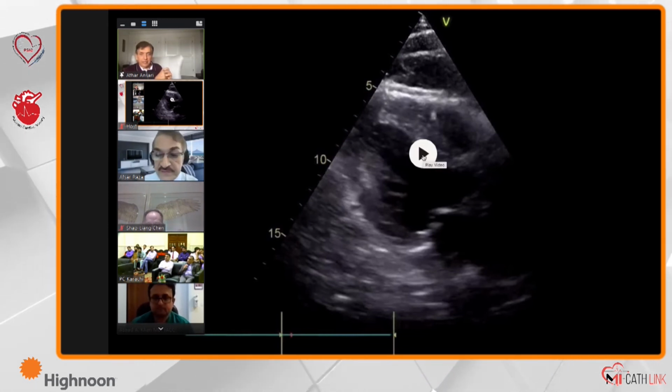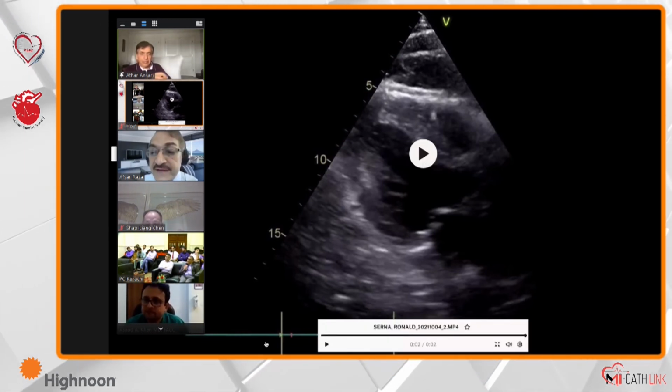Okay, thank you so much, Athar. Can we just remove the slide so that we can have a question-answer session for about 5-6 minutes? Now, my first question is that in this scenario, when you have very little reaction time and you are thinking of a 2-stent technique, I will ask the panelists one by one what would be their choice, the quickest way to do a 2-stent technique. Which technique should be followed in this scenario? So we start, any volunteer from the panelists?